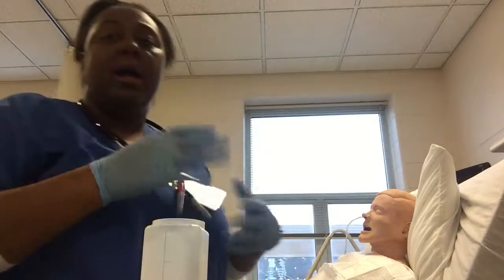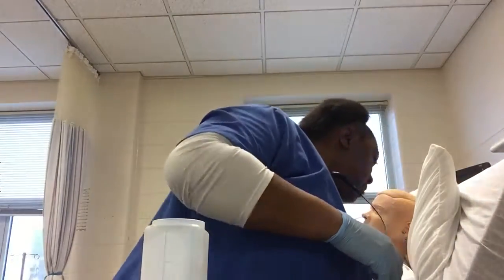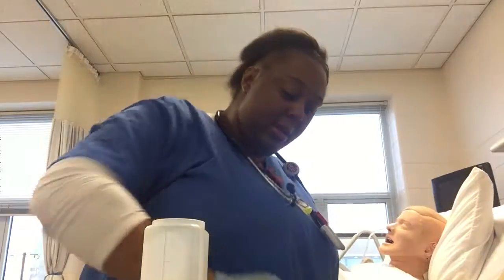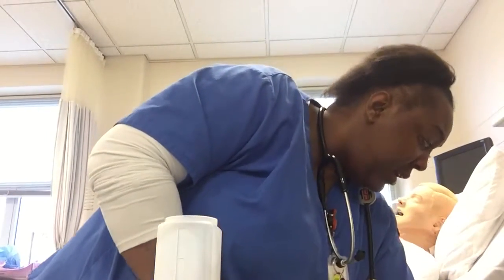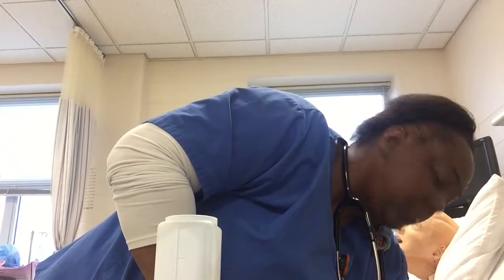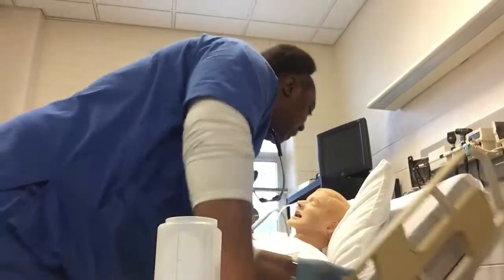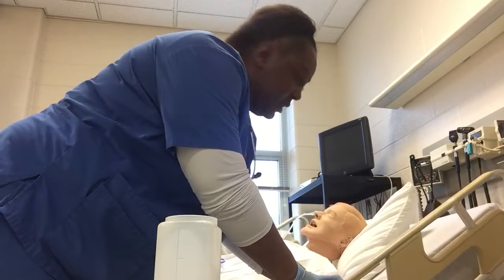Make sure that everything's good. I will clean up my stuff. I will lower the patient bed to proper body mechanics, get them down, and from there, I will give the patient their call light, make sure the side rails are up, and then I will report everything that I did, to include how much fluid was given, how much of the feeding was given, whether or not they took it well, if there were any type of reactions to it.